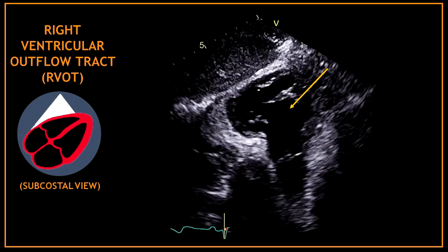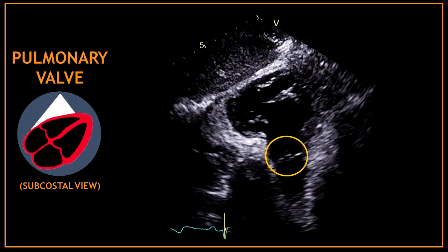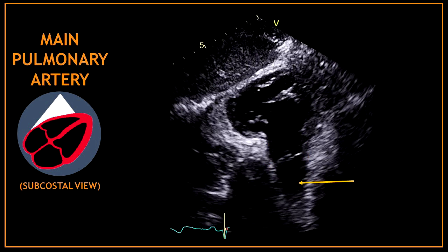You can also see the aortic root or sinus of Valsalva, and sometimes part of the proximal ascending aorta. If you tilt the probe a bit more you can obtain a right ventricular outflow view, where at the top we can see the right ventricular outflow tract, followed by the pulmonary valve, the main pulmonary artery, and sometimes the pulmonary artery branches.